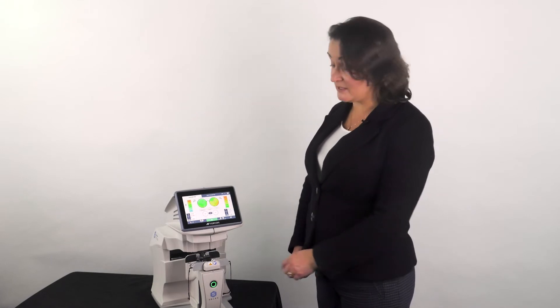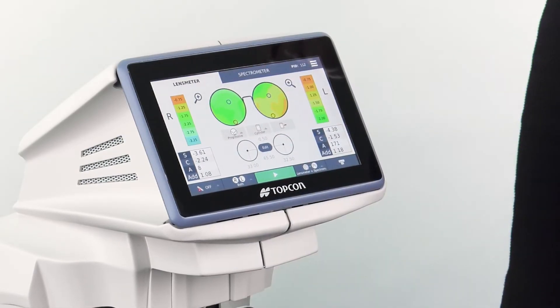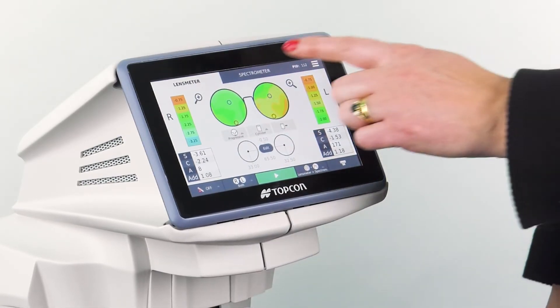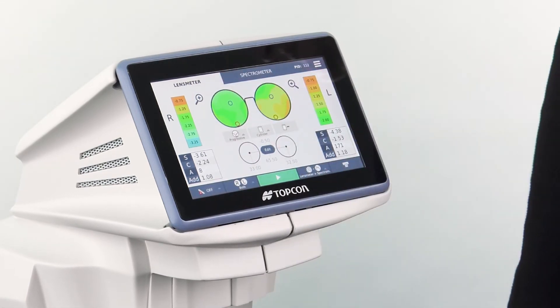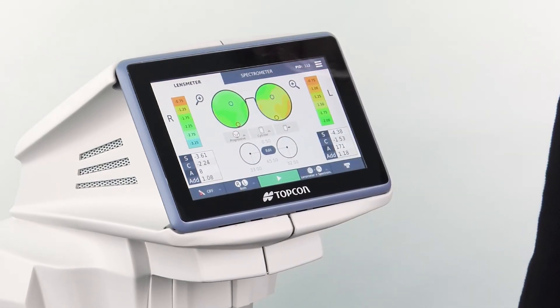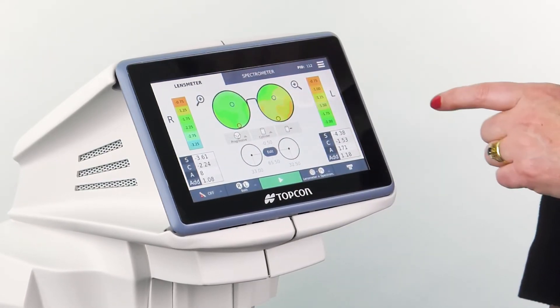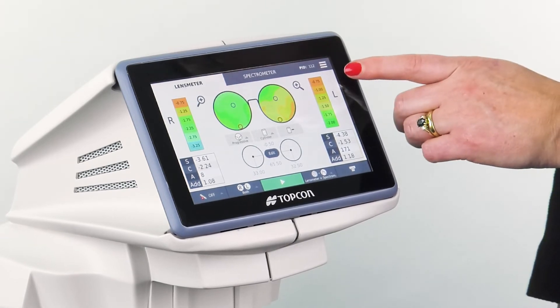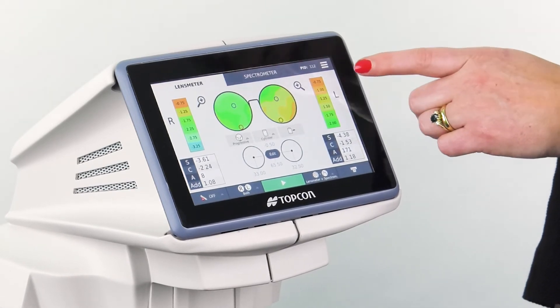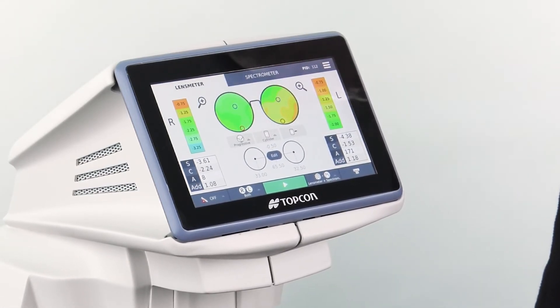The Solos automatically recognises the lens type as progressive, and the power map for each lens is shown at the top. In this case it's set to show the amount of cylinder in diopters, indicated by the colour code down the side.